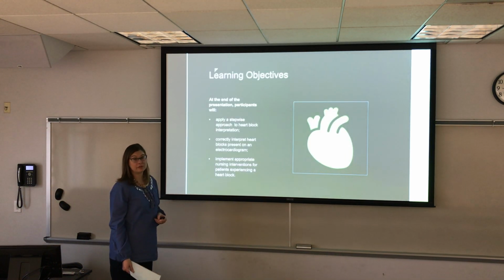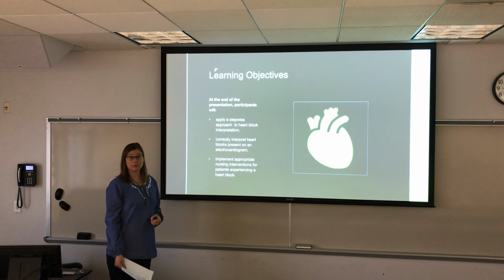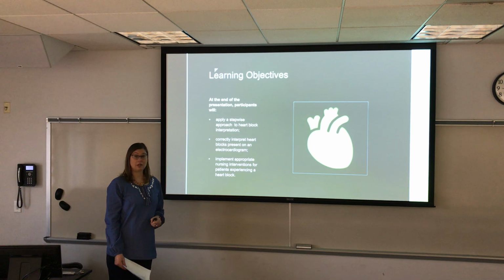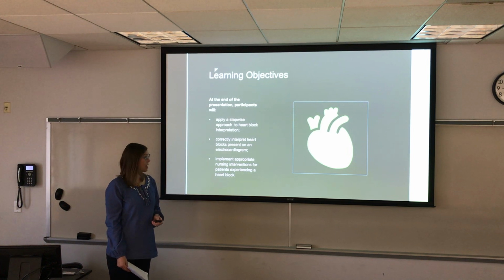So the learning objectives for today are to apply a stepwise approach to heart block interpretation, to correctly interpret heart blocks present on an electrocardiogram, and to implement appropriate nursing interventions for patients experiencing heart block.